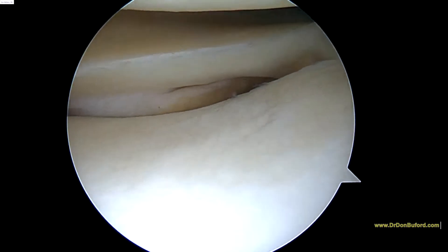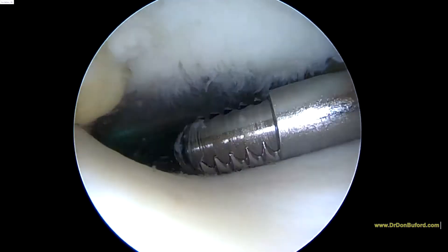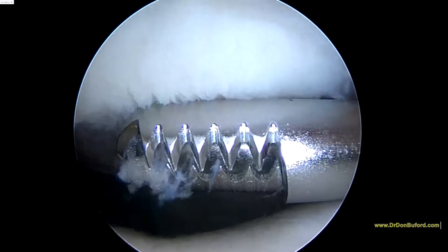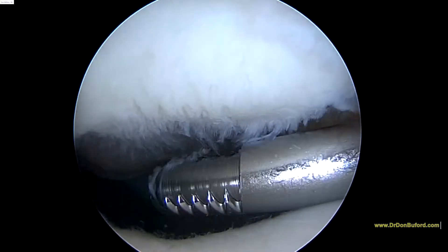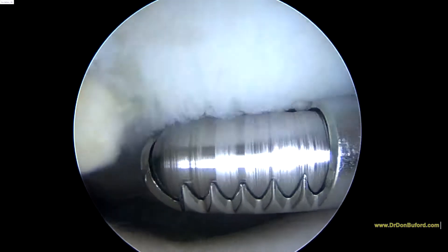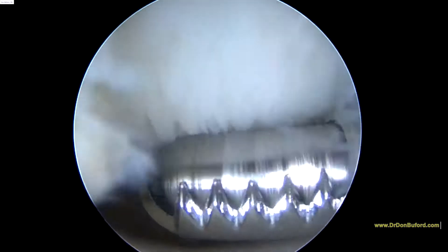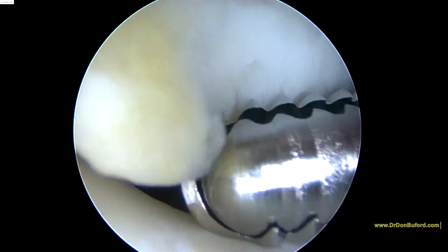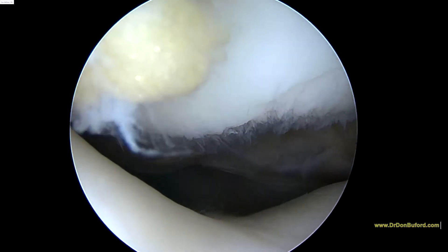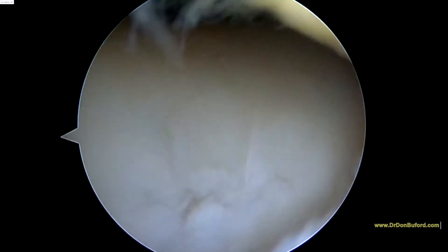We'll look at the patella next. So we're here in the patellofemoral joint — that's the kneecap or patella at the top of the screen. On the medial facet, you've got some softening in the cartilage that you see here. We try to smooth out some of these areas that are loose and soft without removing any of the good cartilage. As we get over to the lateral facet, it looks more normal. The trochlea right here looks good — that's the groove that the patella slides in.